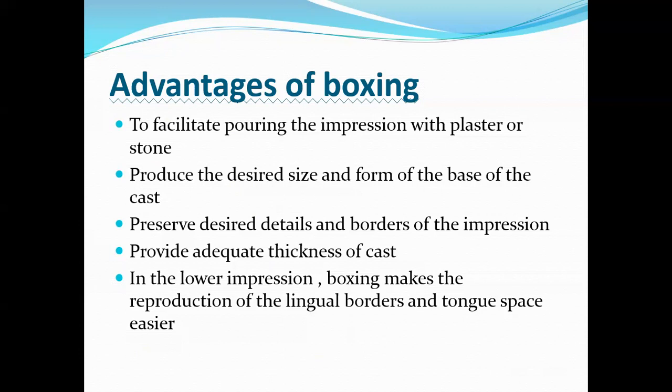This procedure cannot usually be used on impression made from alginate because the boxing wax will not adhere to the impression material and the impression material, which is alginate, will be distorted.